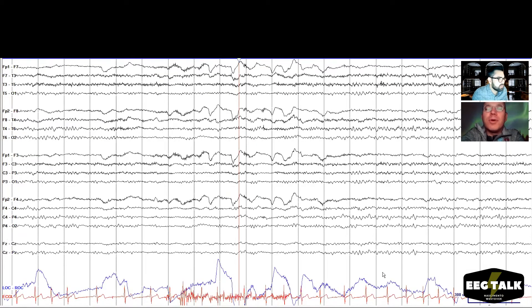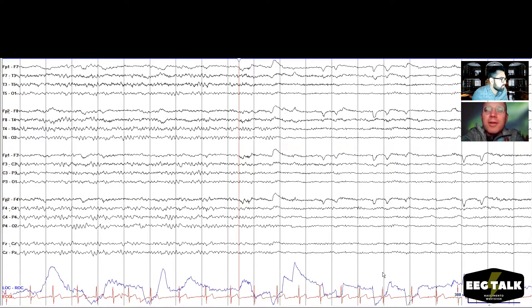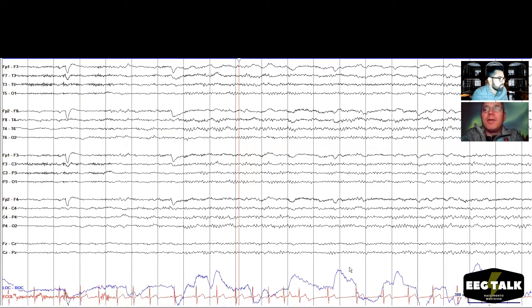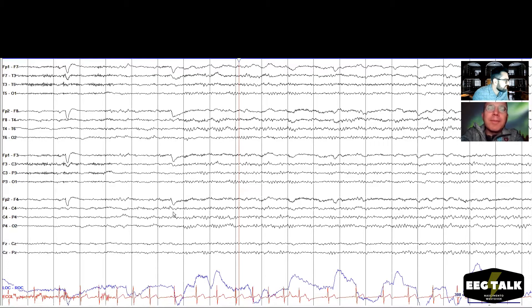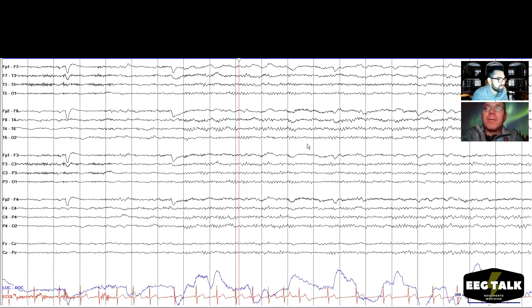I think this kid is so far pretty normal. They got the EKG. I think this kid had some absences in the past. We don't know what the story is though — we don't want to bias ourselves. We just get the age before we look at it. Here's a nice example of not having PDR on the left at the beginning of the page, then an eye closure, and then the PDR comes back. So that's a good example of reactivity — an 11 Hz posterior dominant rhythm reactive to eye closure.